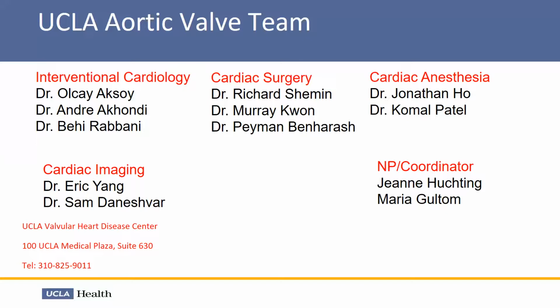The other particular use would be valve-in-valve cases, where you're putting in, say, a 21 valve that was placed years ago. Now inside of that, you need to put a tiny valve, and you're going to come out of the cath lab with a gradient of 20. If you put a Sapien in, like a 20 valve in a 21, et cetera, I'm not going into the fracturing of the valves, but really it's going to be a higher gradient. So because of those things, putting in a supra-annular valve has some advantages.